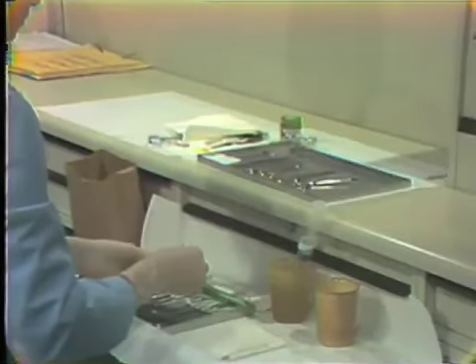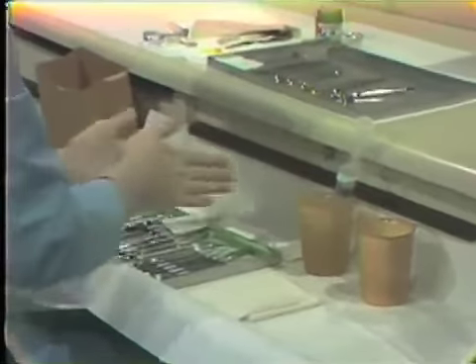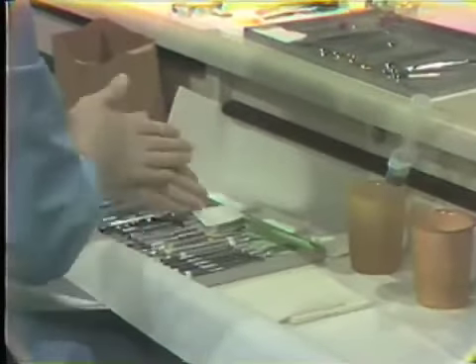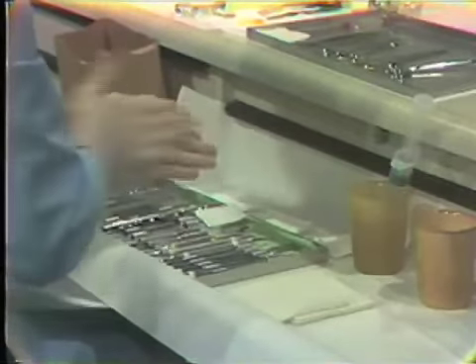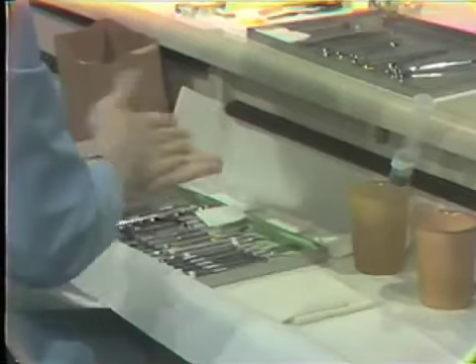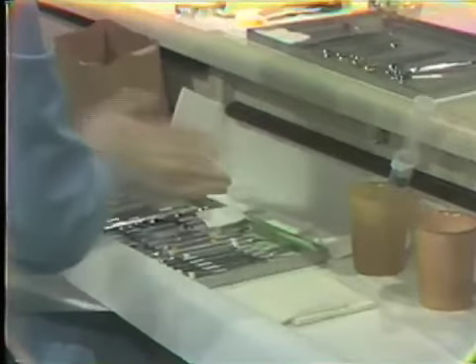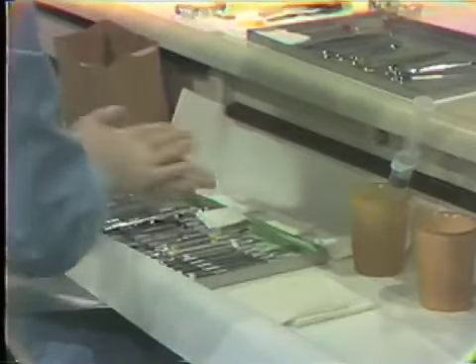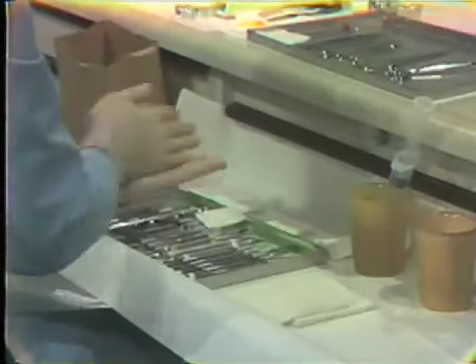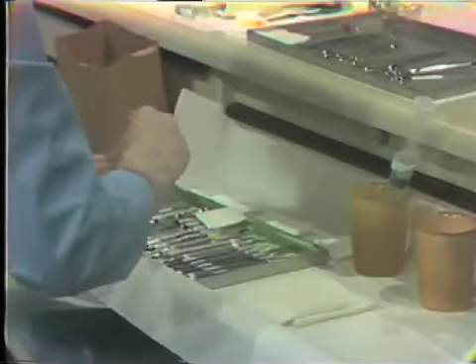This material has been pre-mixed and has been placed out so that at the time of surgery, manipulation by rolling in the hands, rolling between the fingers, is adequate for softening of the dressing and placement at the surgical site. Occasionally, the texture of the dressing may be more firm than at other times based on the amount of powder that has been incorporated into the dressing. It may require a fair degree of manipulation or rolling in the hands. At other times, if the dressing is more soft, less manipulation is required.